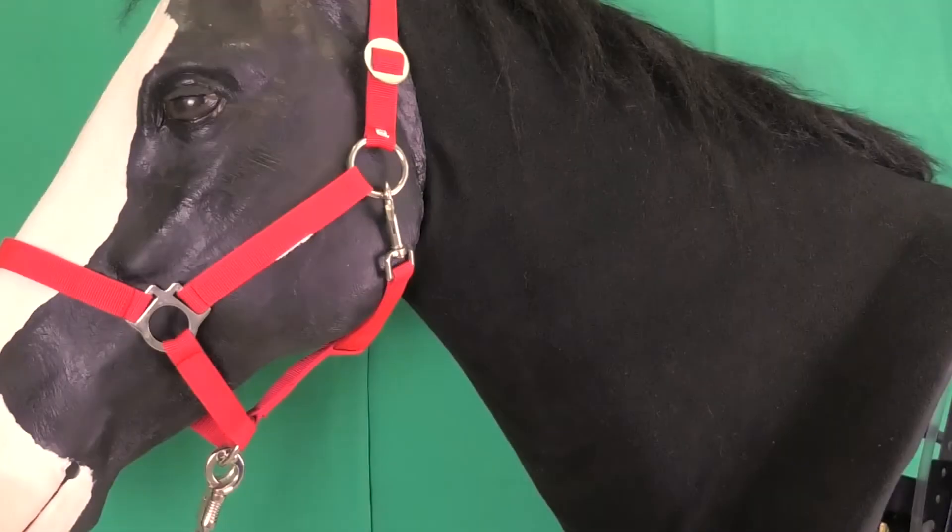The horse's head is fixed into position by an assistant. It is best to keep the horse's head slightly stretched. If fixating the horse in this manner is not sufficient, snaffling the horse, creating a neck fold, or using a twitch can help. The fixation is not carried out on the simulator.